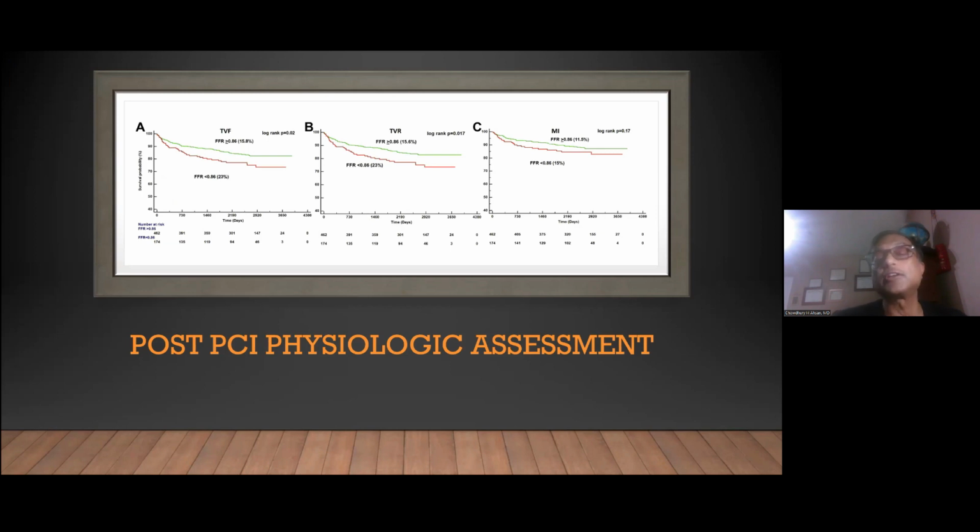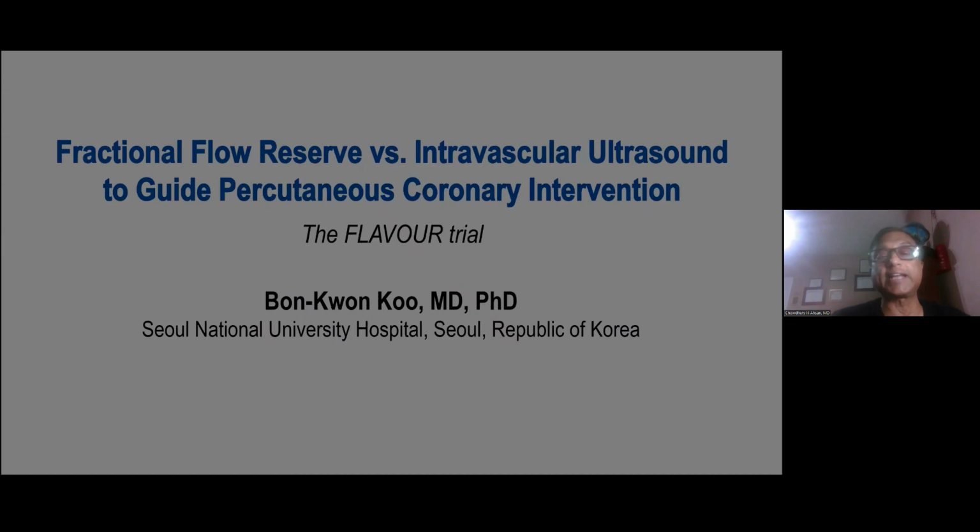So physiology only after the PCI, there is a difference. So those who are following the physiology guided with the fractional flow reserve, and many studies now have correlated this with the iFR also, or non-hyperemic pressure ratio, clearly there is an advantage when you can correct the problems identified by the post-PCI physiologic assessment. Question now is which one we should do?